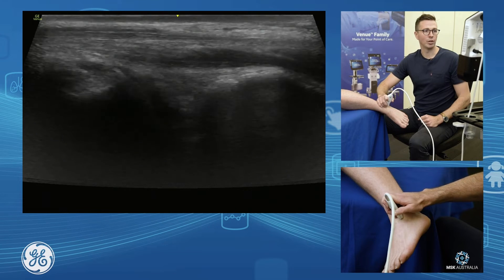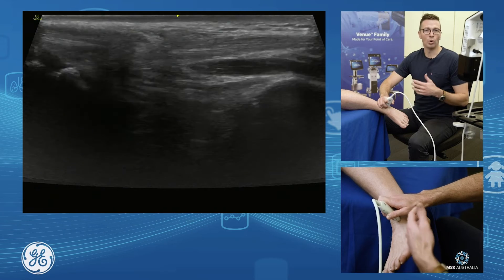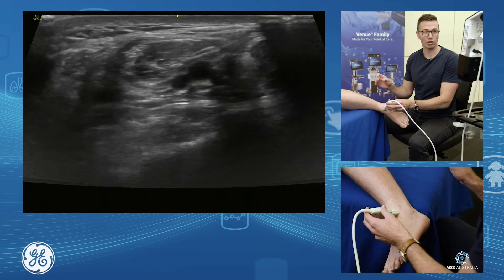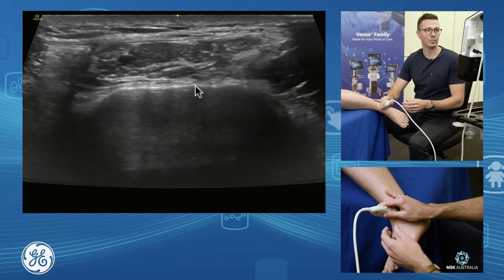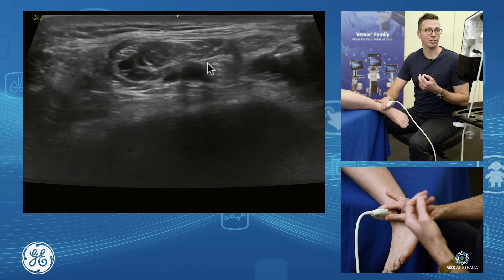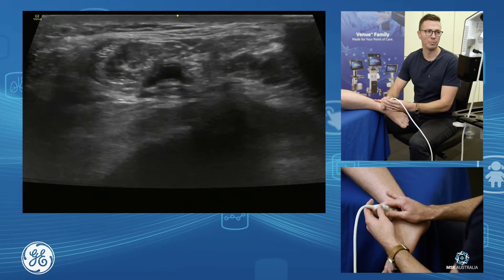To do our anterior ankle joint injections, there are many ways of going about it. All you need to do is avoid the neurovascular bundle, which is very easy to pick up. If you just go short axis from the front of the tibia and come down, you'll pick up your dorsalis pedis with its veins on either side, and our deep peroneal nerve sits just adjacent to the dorsalis pedis. So all you need to do is avoid the front of the ankle joint.